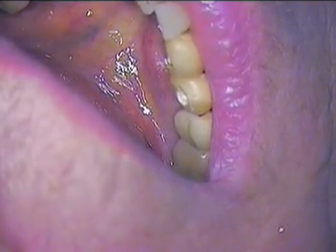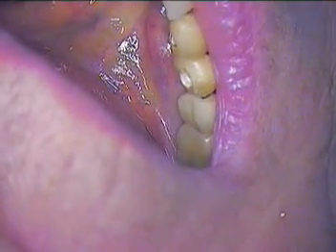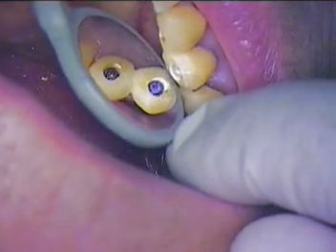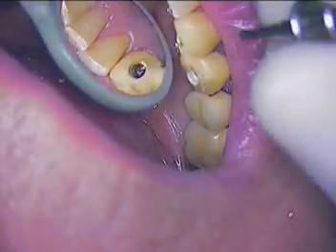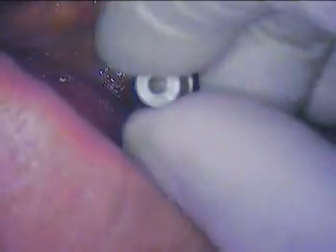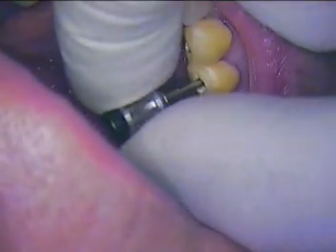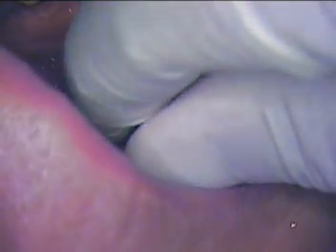Good morning. We're live here in Boca Raton. I'm Dr. Jerry Cuomo, and I'm working on a patient whose grandson attends University Buffalo Dental School. His name is Joseph, and Joe, we're just doing a little shout out here. Your grandma says hi, and we're working on her implant. We just uncovered the screw-retained temporaries.